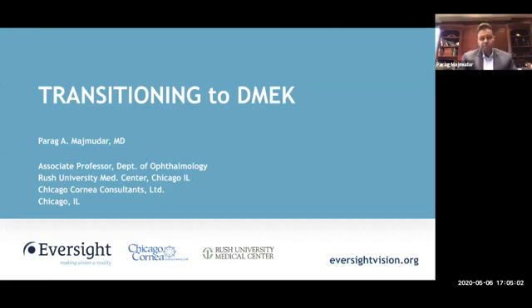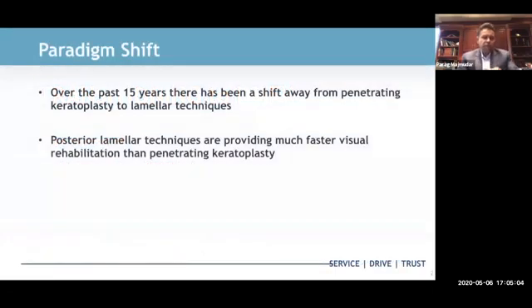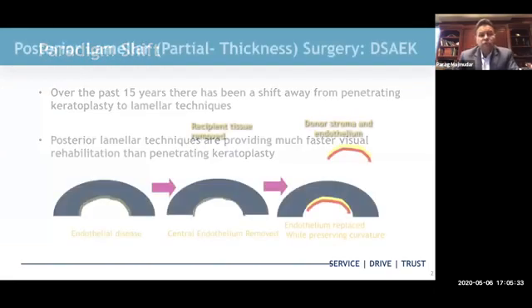Over the past 15 years, I'm sure you've all seen that there has been a tremendous shift away from penetrating keratoplasty towards lamellar techniques. While we can talk about anterior lamellar techniques in a different webinar, today we're going to specifically focus on the posterior lamellar techniques, which have really gained a lot of popularity among corneal surgeons because the visual rehabilitation is much, much faster than we've ever seen in the past with penetrating keratoplasty.